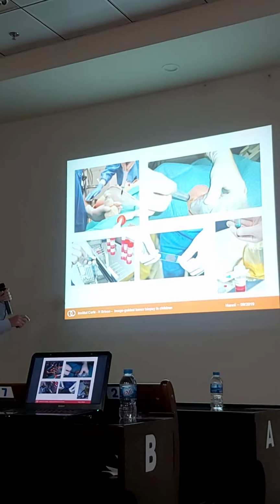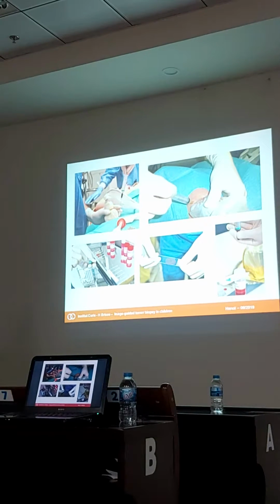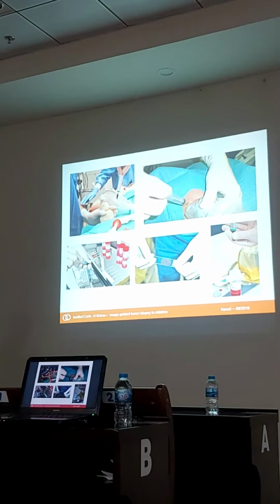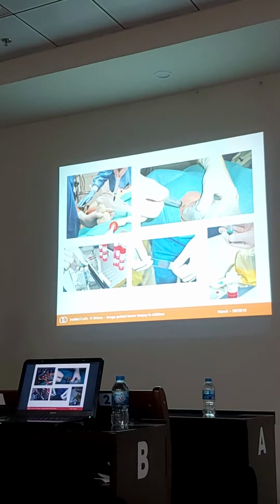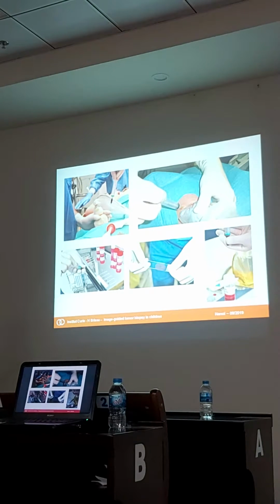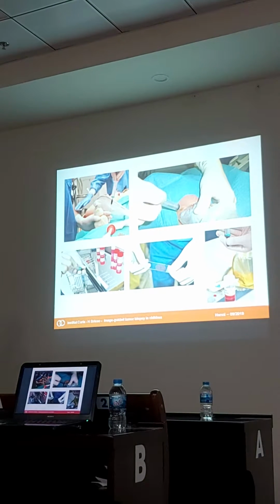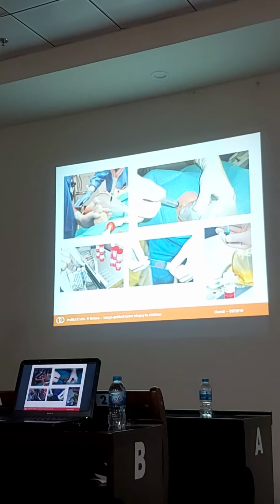So this is how we do. We put first the introductor. After the introductor, we first perform the fine needle aspiration, and then after that we do the biopsy. So for the needle aspiration, you put the needle with a syringe, you just make a small aspiration, and then you put in and out in the tumor with image guidance, and then you can get the slices and make smears.